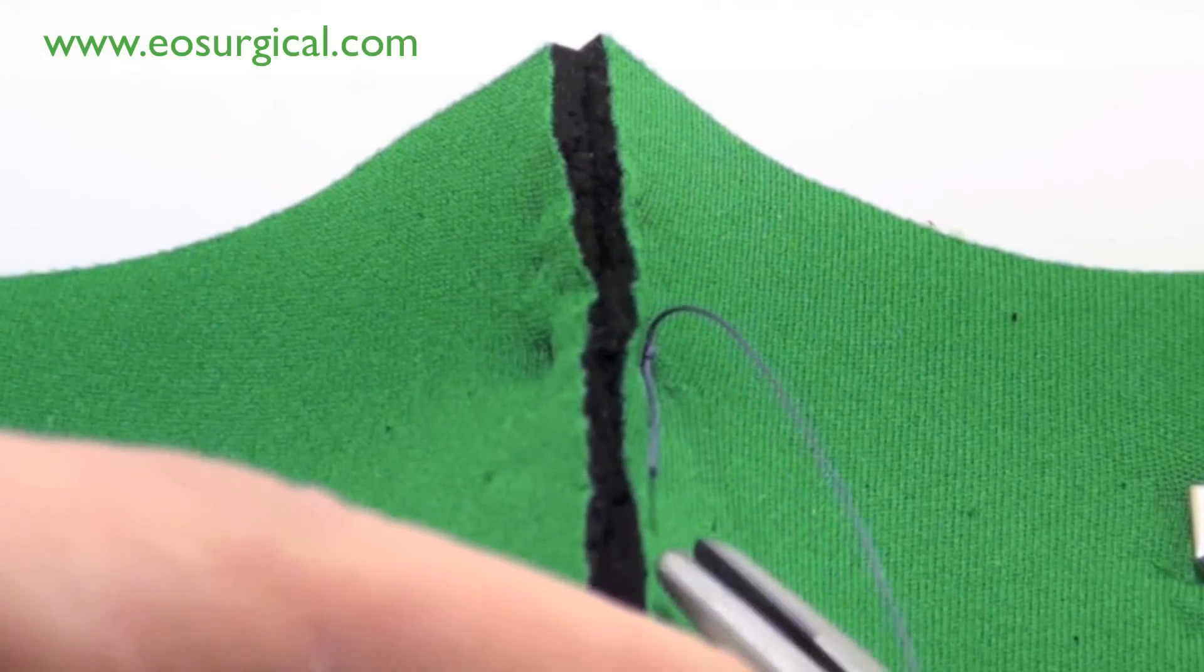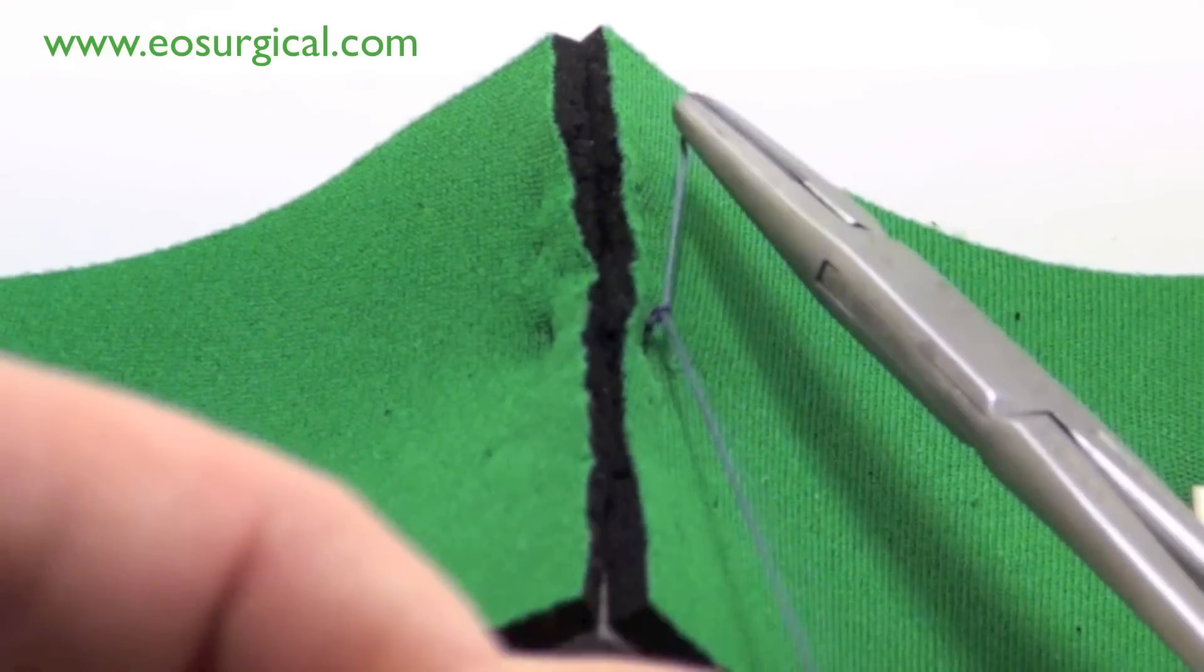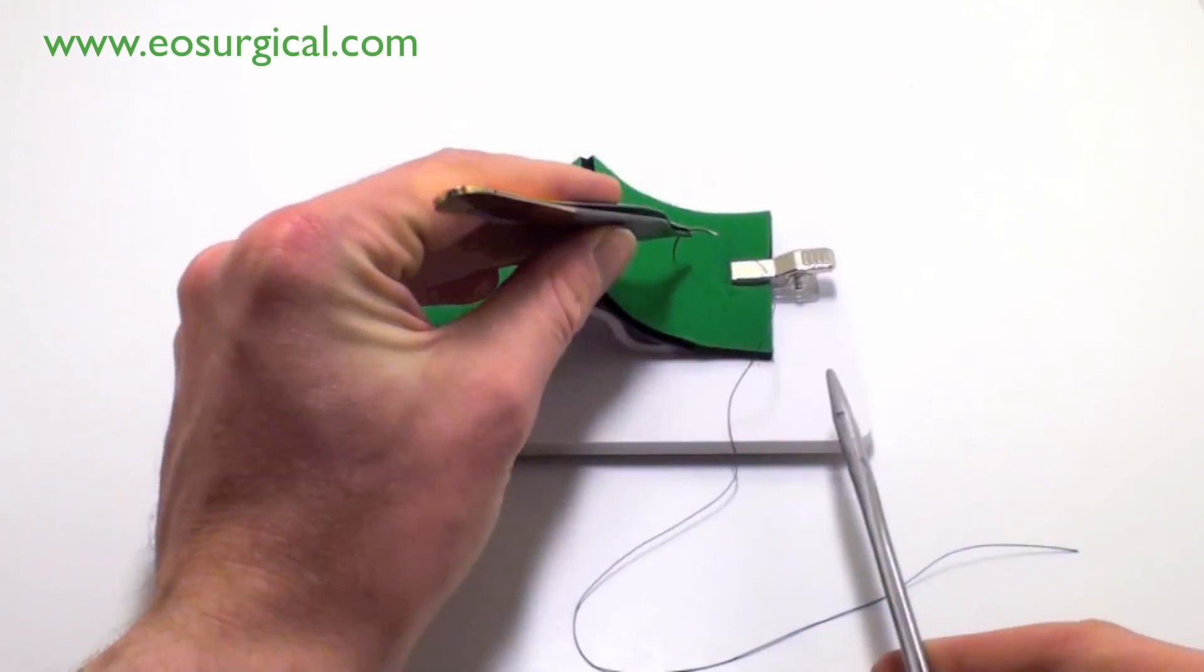Now, you've got to watch for the sutures. You can actually apply quite a lot of force. If you apply too much force, you will cause tissue necrosis.